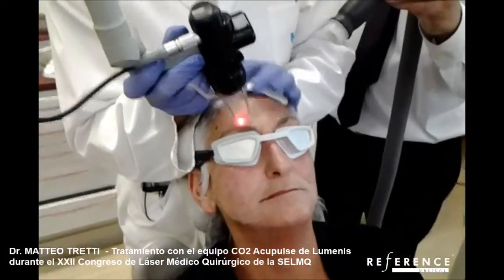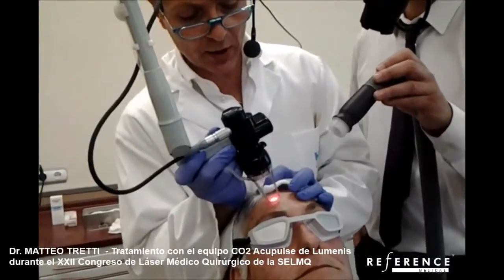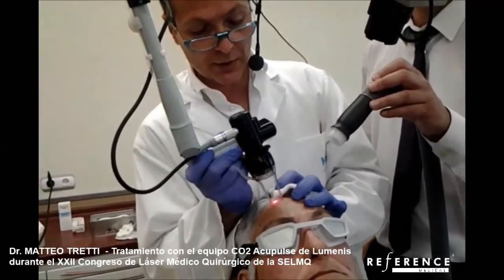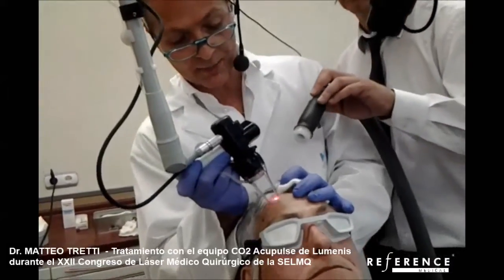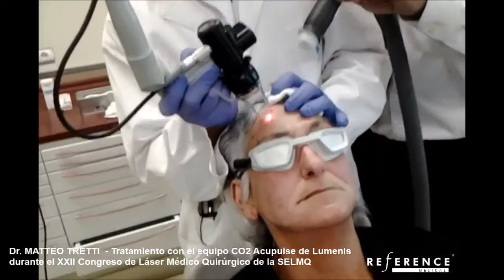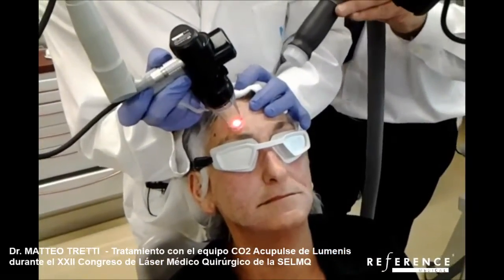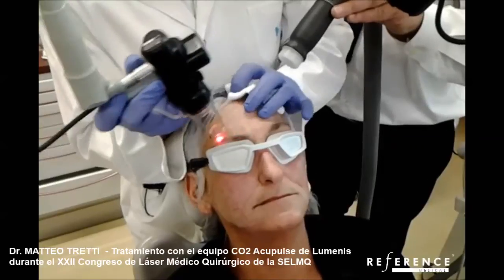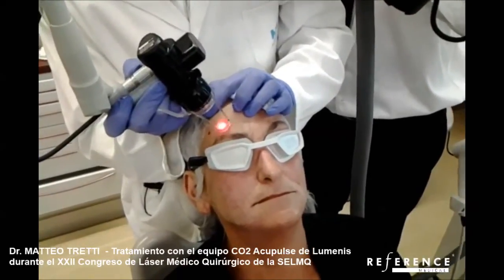As I showed at the beginning when treating deep wrinkles, I want new collagen production exactly at the base of the scar. Then I pass with the combo to try to shrink the scar and to have a better appearance of the skin.